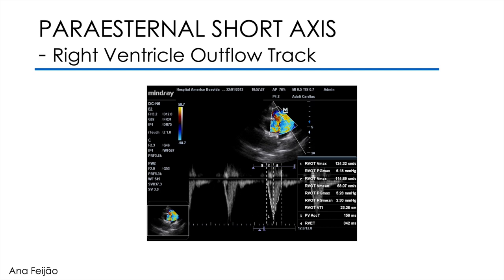Another flow that is important to evaluate is the right ventricle outflow tract flow. I keep the color Doppler window as it is. To evaluate a specific zone — the right ventricle outflow chamber — I choose Pulse Doppler PW. When activating the PW command, a cursor is called automatically and I align it with the systolic flow. I set the sample to 4 mm or less and place it 5 to 10 mm before the pulmonary valve. You can see in the image above that the pulmonary valve is here and the Pulse Doppler sample is placed before the cusps.